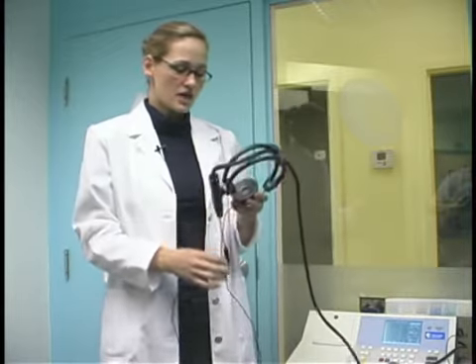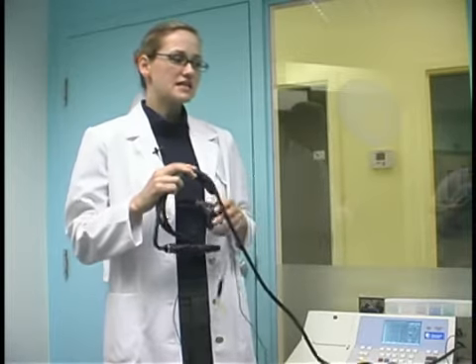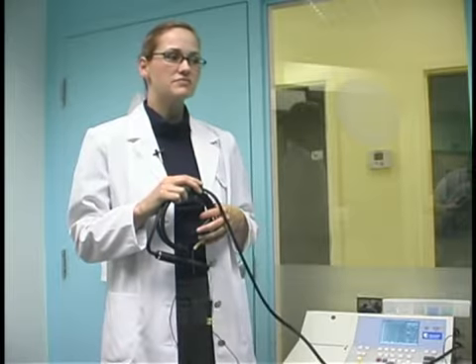Another test that we do is to evaluate the function of the middle ear. That's the part of the ear that's located right behind the eardrum. One of the tests that we do to do that is called tympanometry. What this does is it evaluates what we refer to as the impedance of the eardrum, or the ability of the eardrum to allow sound to pass through.